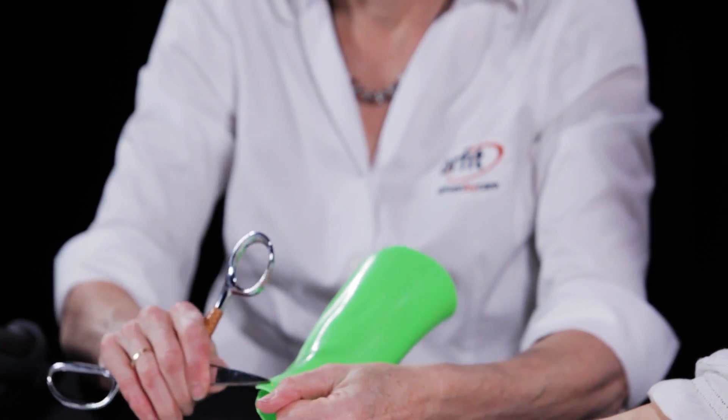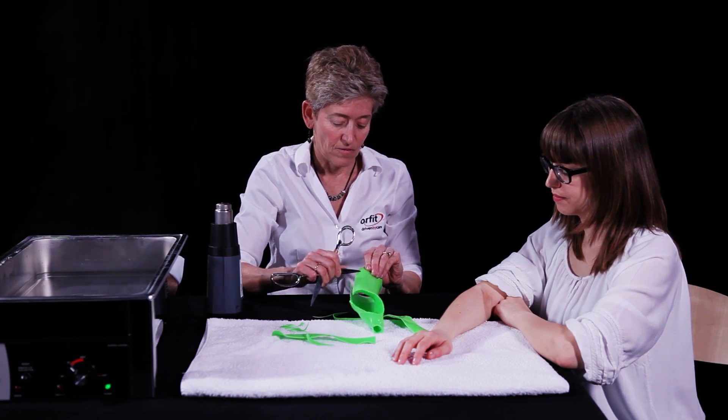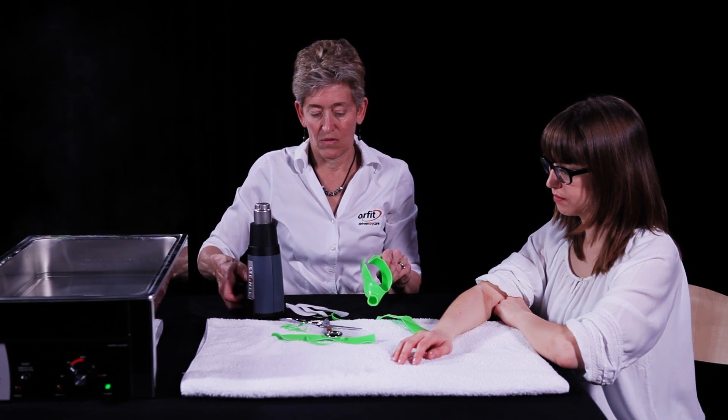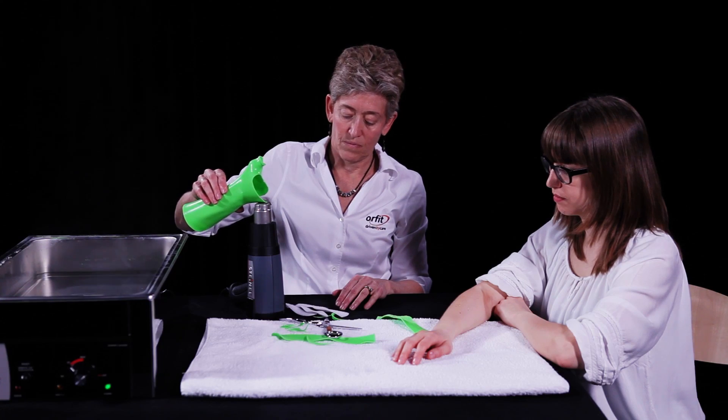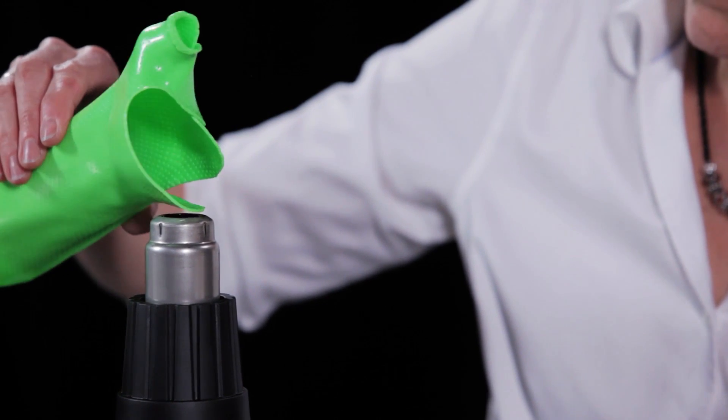Velcro loop straps can be attached directly to the thermoplastic material. Orfit Colors NS has a coating which must first be removed by scraping with scissors. Heat each spot with a heat gun briefly. Make sure not to overheat the material as it will lose its shape.